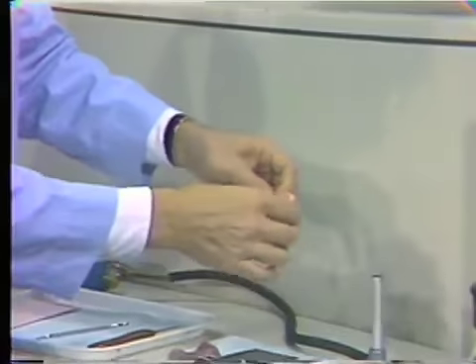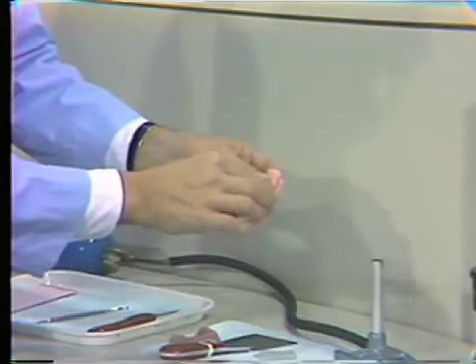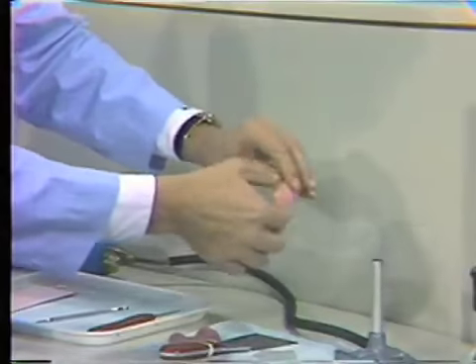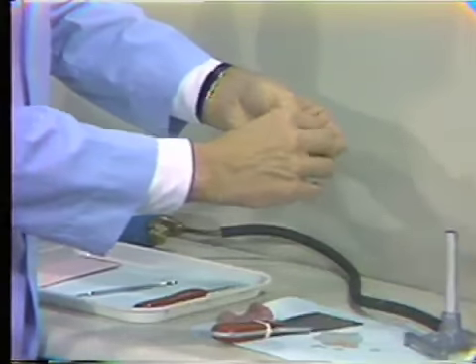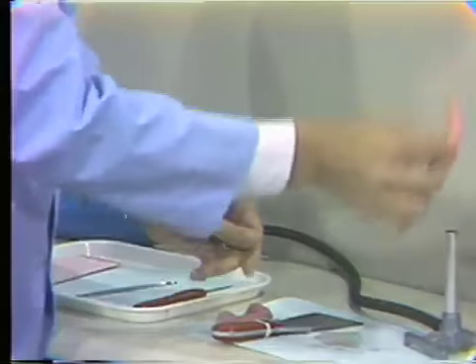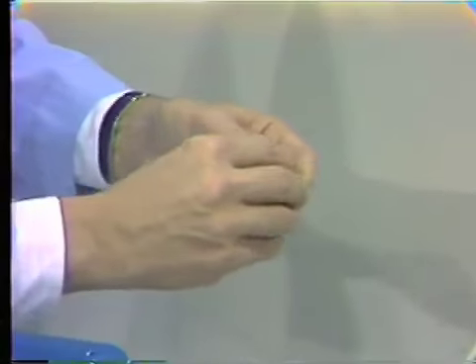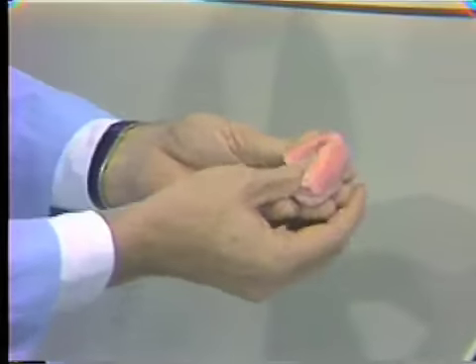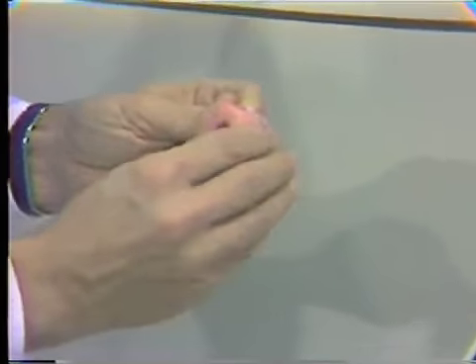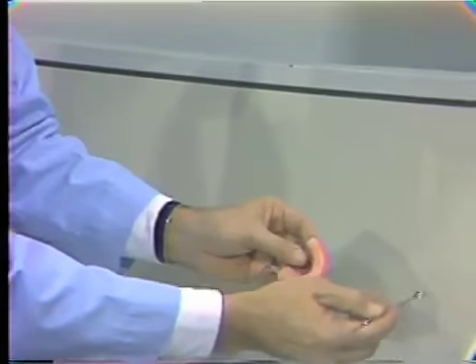We now have the maxillary rim in soft wax, and the patient then will close into the soft wax with the hard wax of the lower. Now we can shape this with our fingers and form a tentative occlusion rim. And we will fix that roughly the shape that we want and seal it with the number 7 around the borders.